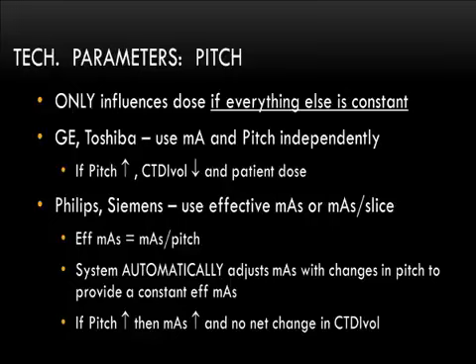So I learned that this slide is slightly incorrect, but that's okay. It's close. GE and Toshiba use MA and pitch independently. So if the pitch is increased, the CTDI vol will go down, and patient dose will also go down. For Toshiba, that's not 100% true, but it can be true. So there, you're going to have to look at your user manual on that one. I wish it were always true, and I gave us the whole truth.